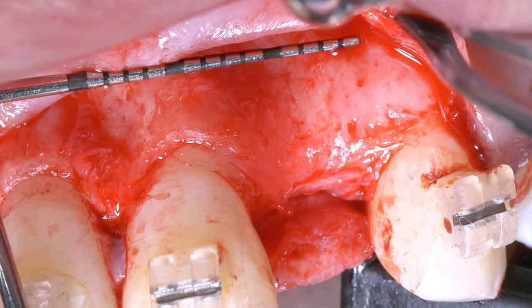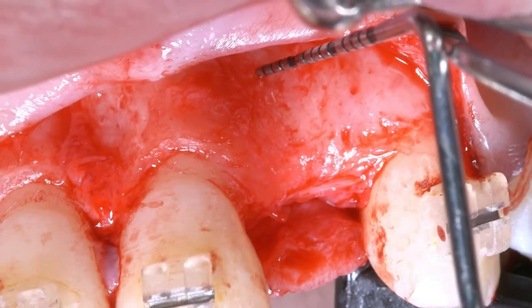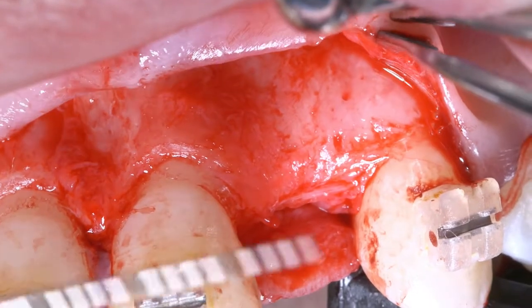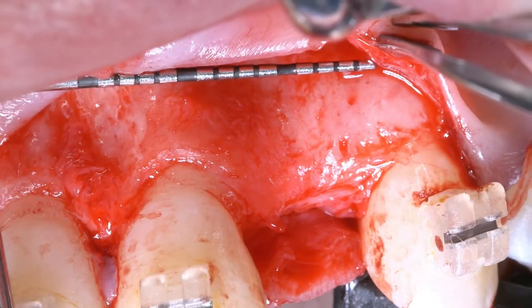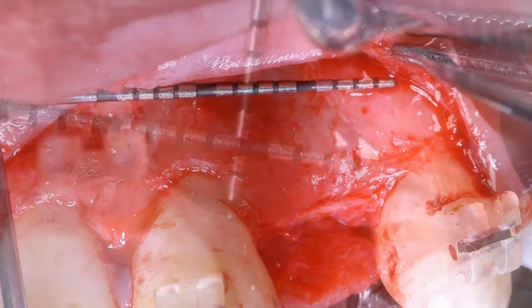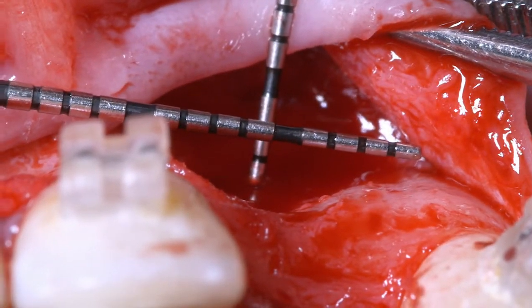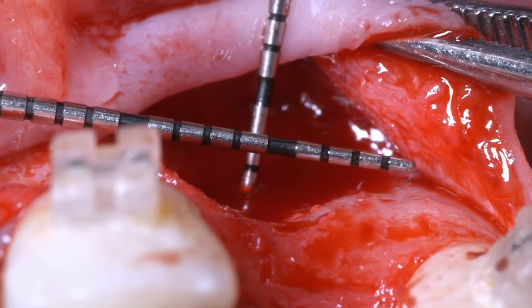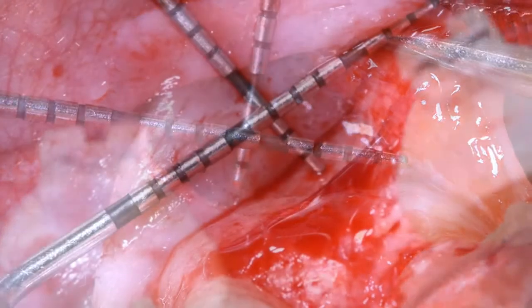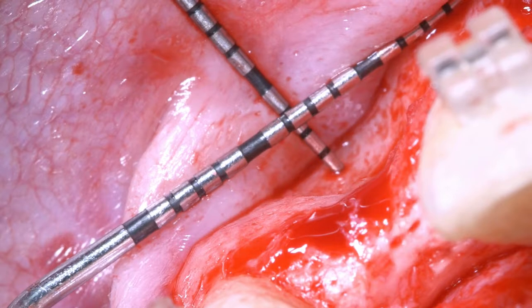That's a simple, straightforward case that can be done simultaneously with implant placement, but I didn't do it just because I waited for the orthodontist to finalize the case and to create for me enough mesodistal width to place the dental implants. So here we can see that we're missing the 3 millimeters that we could measure before raising the flap. And remember the concept of having this buccal bone balcony to support also the soft tissue.